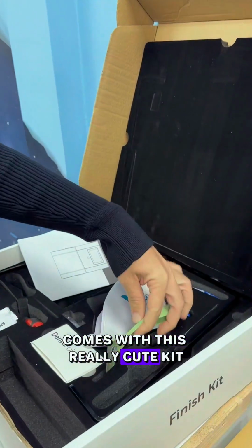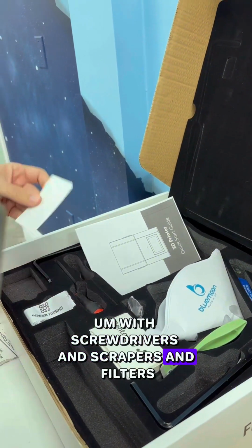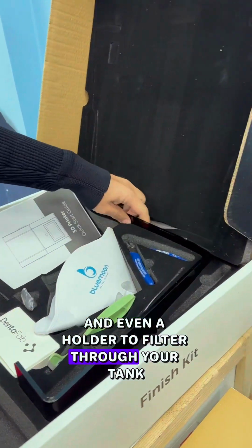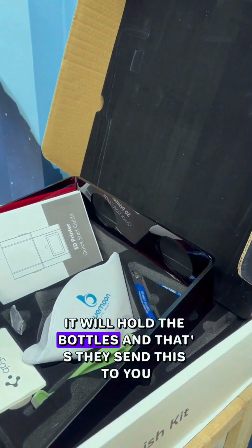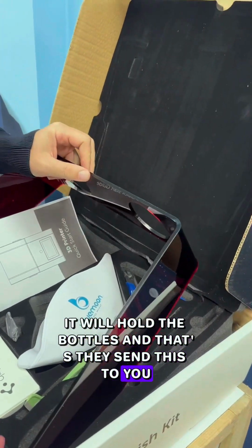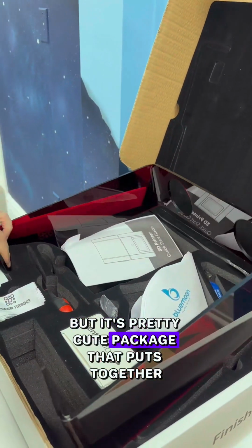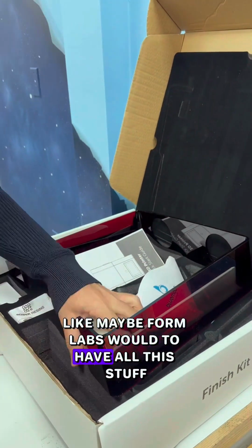It comes with this really cute kit with screwdrivers and scrapers and filters and even a holder to filter through your tank if you ever have like some failed prints. That will hold the bottles in, and they send this to you. It's a nice little package. It's not an Apple packaging, but it's a pretty cute package that puts together. They don't charge you extra like maybe Formlabs would to have all of this stuff.